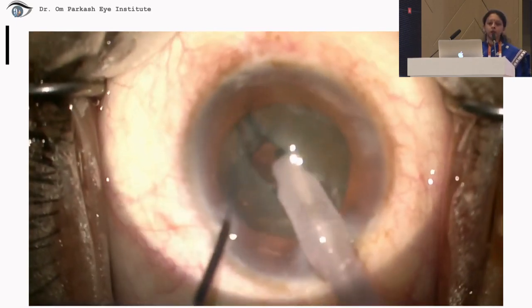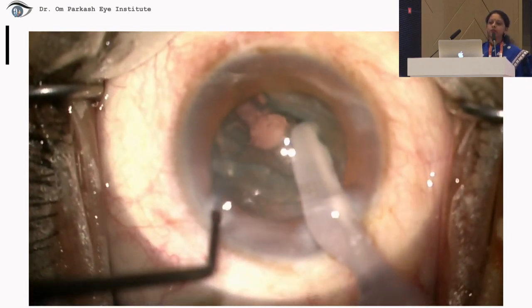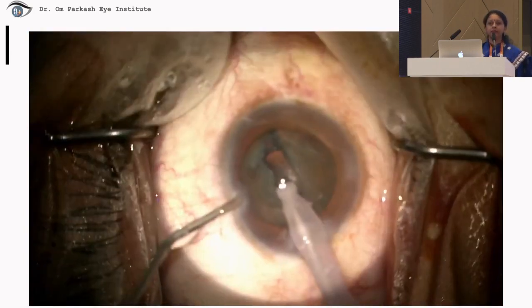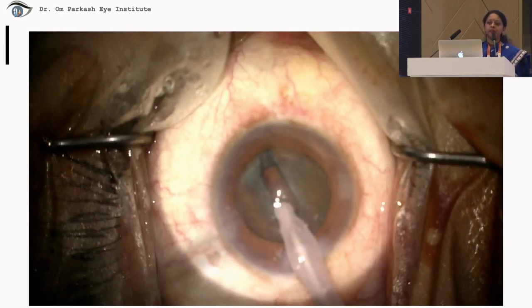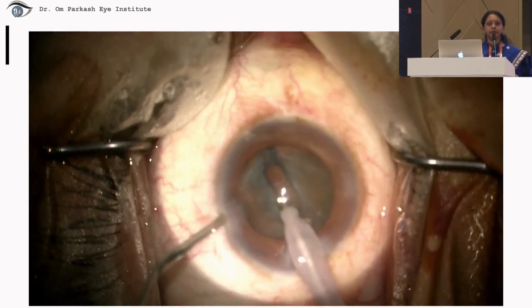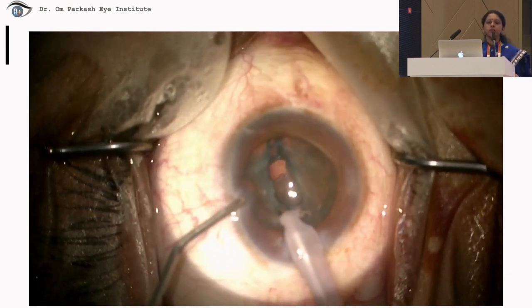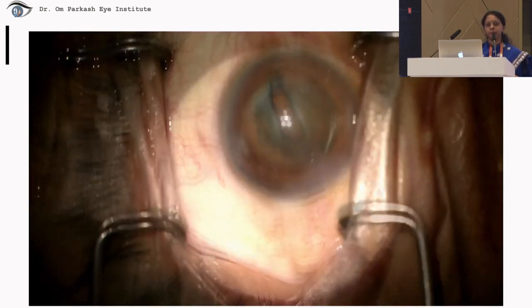You can see a round punch in the posterior capsule. The surgeon is oblivious to this, and the surgery is continued, trying to separate the nuclear hemispheres, and we can see at this point it is realized that something is wrong. We can see the exaggerated glow. So a PC rupture has occurred while trenching.